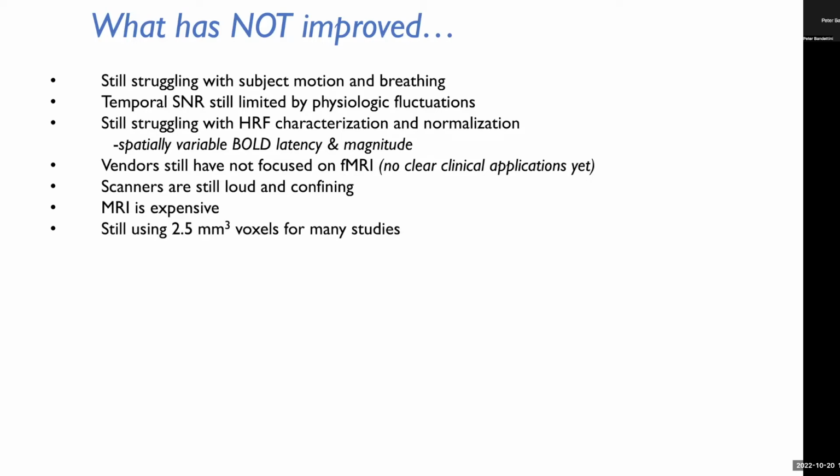Many studies are still using 2.5 millimeter voxels, which was maybe a little bit higher resolution than on day one. We don't really understand, and this is my opinion, but I think it's true, connectivity as inferred by correlation. When we see correlations, we say the areas are connected, but we don't really know that.